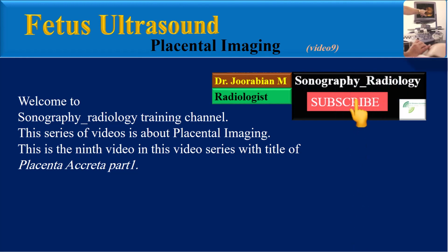This series of videos is about placental imaging. This is the 9th video in this video series with the title of Placenta Accreta Part 1.